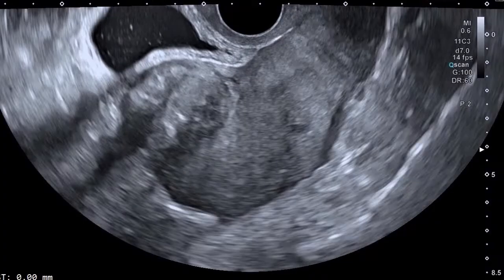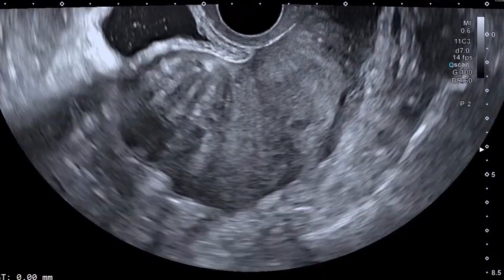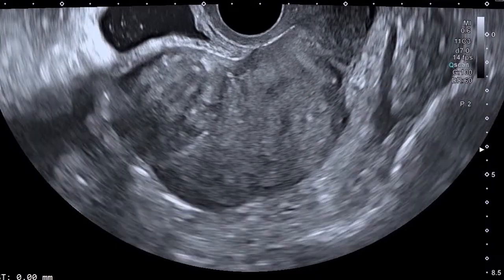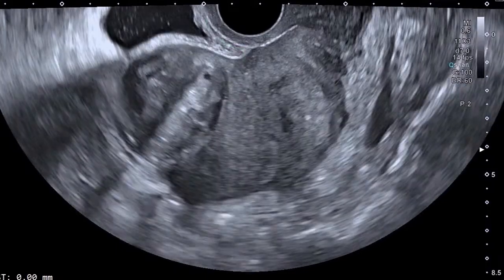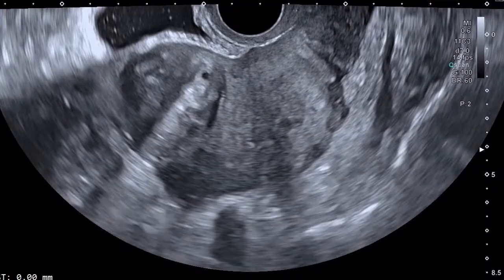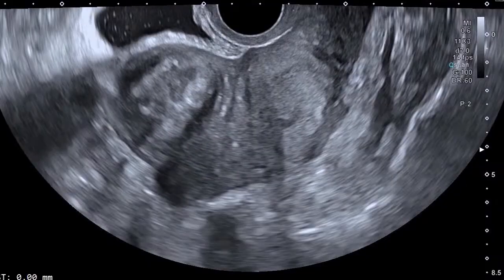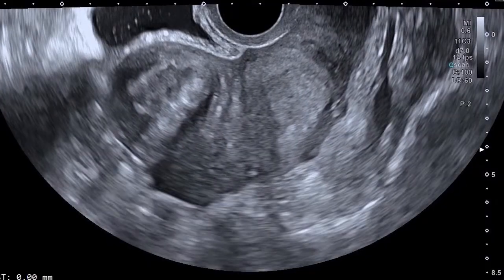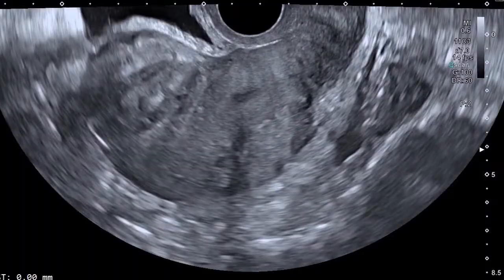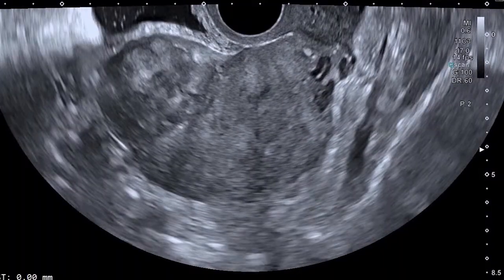So the first thing is a transvaginal ultrasound. You can see here there's a fibroid. This is not the shocking thing. This is a nice subserosal fibroid there. You can see this peripheral vascularity. That's our uterus there. You can see the blood vessels there. That's the bladder there, which is fine. So the fibroid is here. That's a well outlined fibroid there.